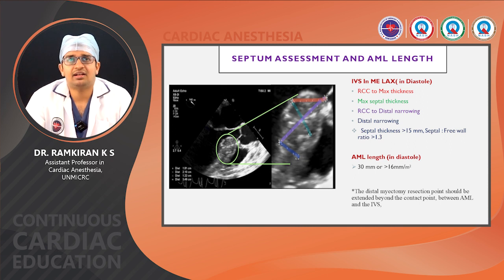And the anterior mitral leaflet length, in diastole, from the annulus to the tip of the anterior mitral leaflet when the valve is completely open, we have to measure.